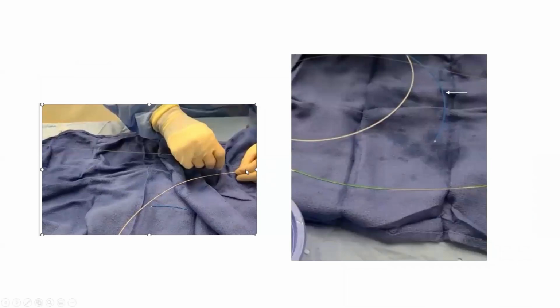So after positioning your wire, now you're ready to take your catheter out. The catheter is a monorail system. You take it out in a monorail fashion, but don't throw it away, because the forward end of it is the delivery catheter, which is green, but the back end of it, that blue portion, is actually the retrieval catheter that you will need to use at the end of the case. The retrieval catheter is a little bigger than the front green portion because you need bigger room to collapse that basket, especially if it has debris.